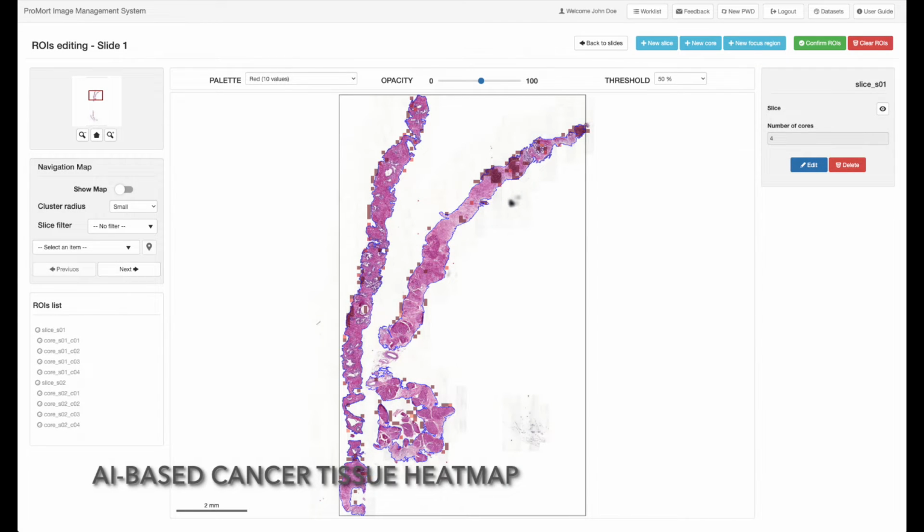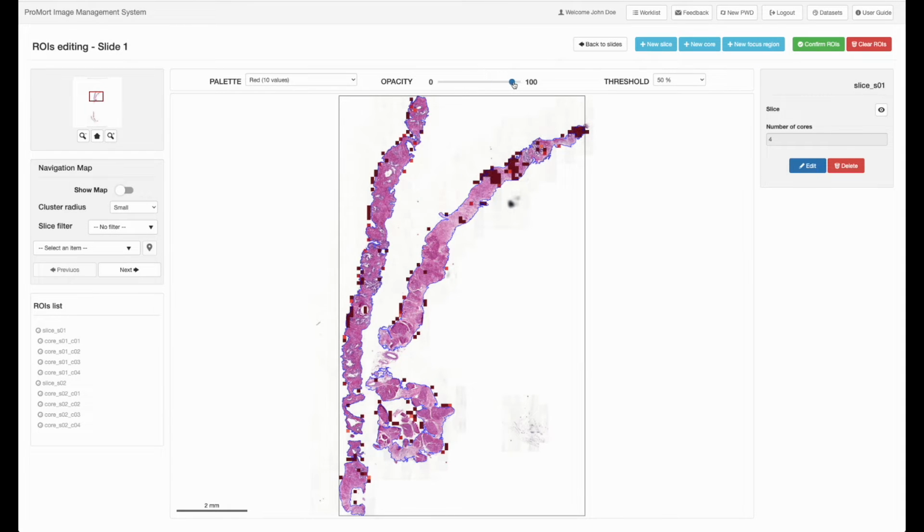borders. A second, new DeepHealth-based deep learning model was created and integrated to identify probable prostate cancer tissue. The inference output of this model powers the computer-generated annotation of cancer areas on the images, as well as new advanced pathologist support tools that have been added to the platform.